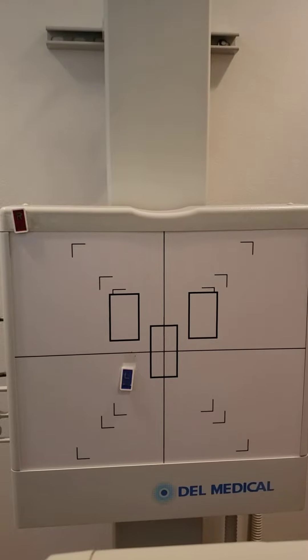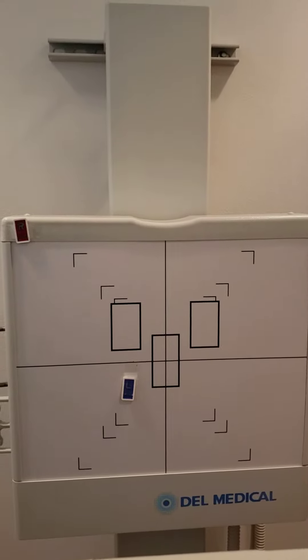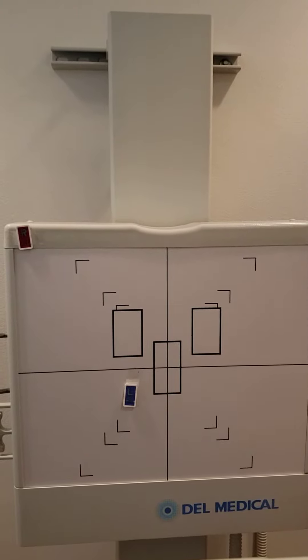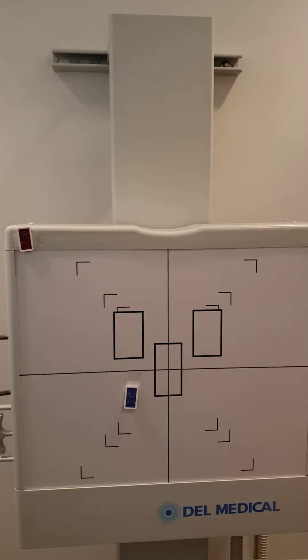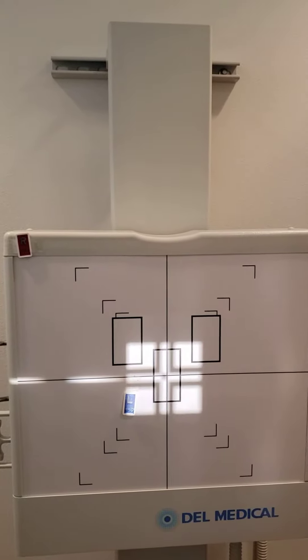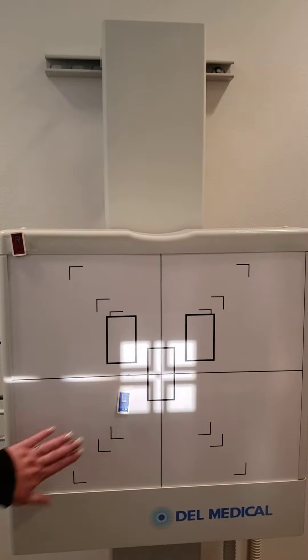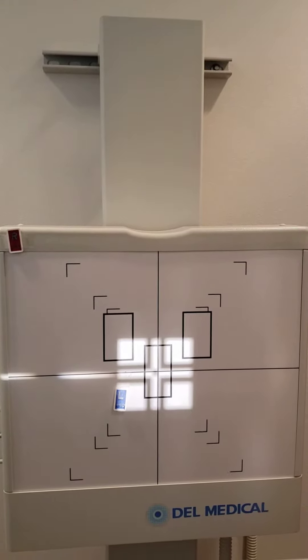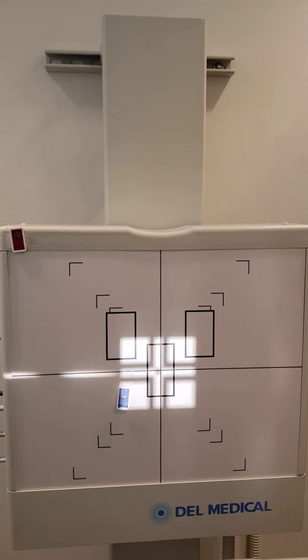This is the sternoclavicular joints. We're going to start with the PA and then we'll do both anterior obliques. We've got a 40 inch SID, a 6 by 6 collimation. We're going to start with the left marker in the left lower corner and we're going to have the patient face the image receptor.